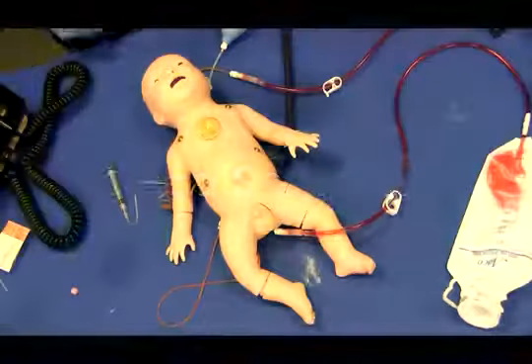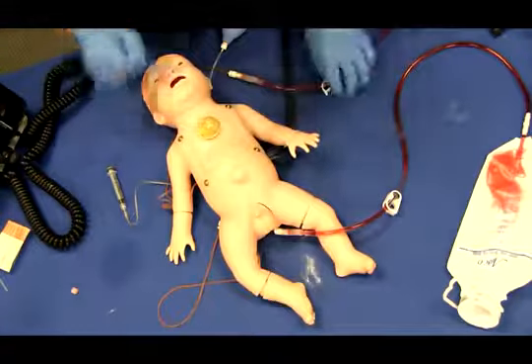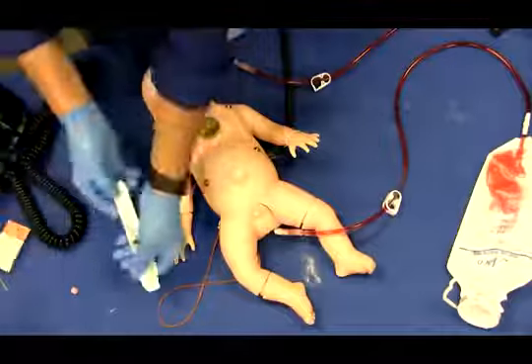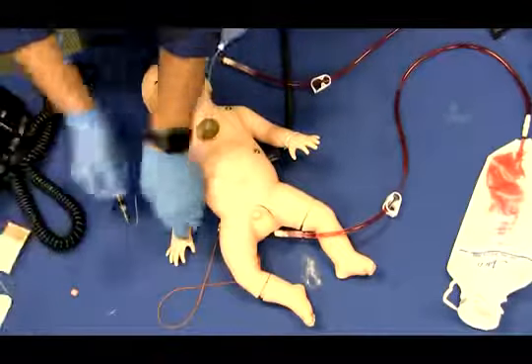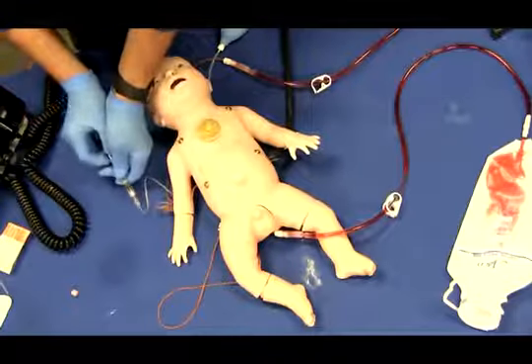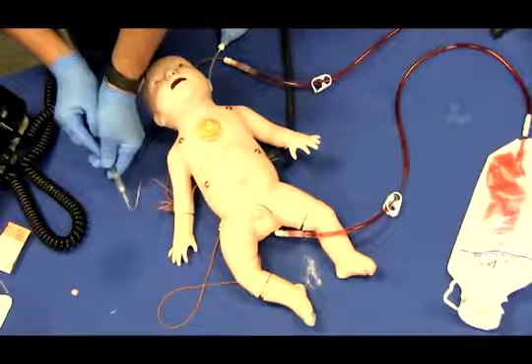For blood sampling, using one of the included 25 gauge needles, follow institution guidelines to perform blood withdrawals in the hand or foot. Flashback will occur when the needle is in proper position.